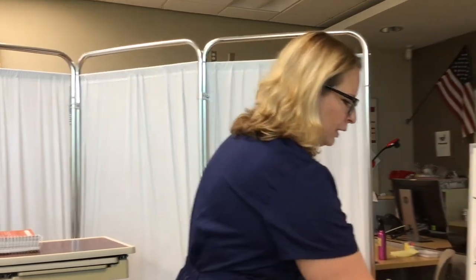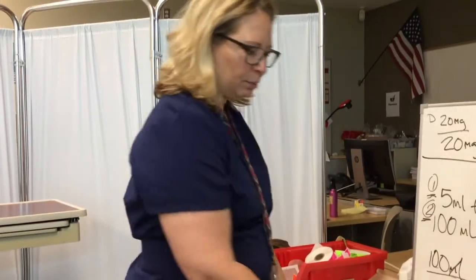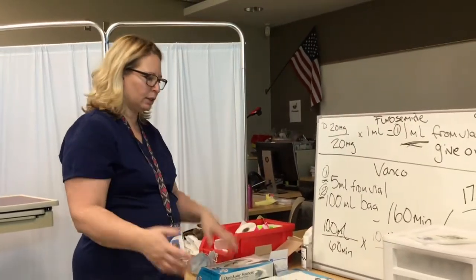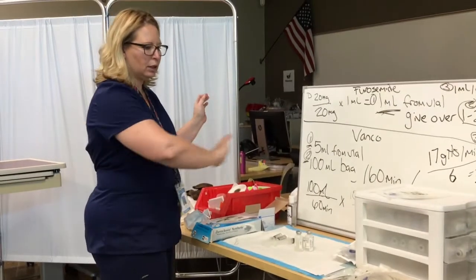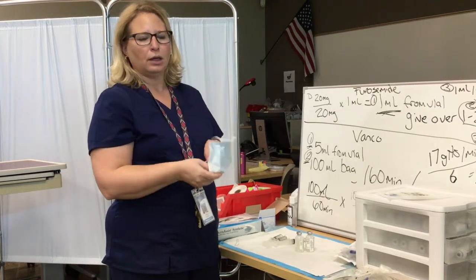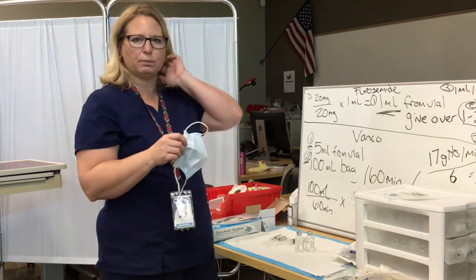So we are going to be in a med room. In a med room, you should be using a clean space. Again, if you're using your bathroom counter or your kitchen counter, I understand it's not a clean space. In a pharmacy, they are very, very, very sterile, clean chlorhexidine space. They're under a hood. They actually discourage us from mixing up meds on the unit. This is probably not going to happen very often, except if you need to pull up a push.